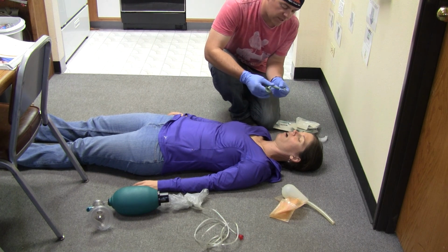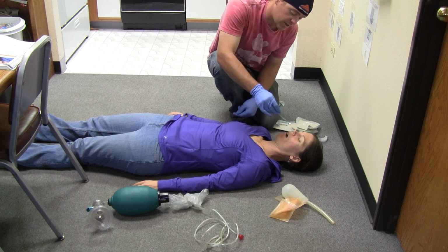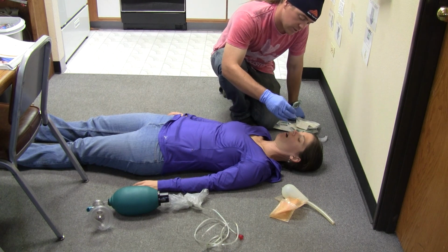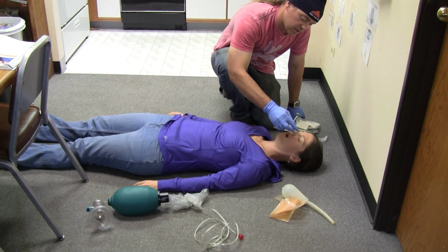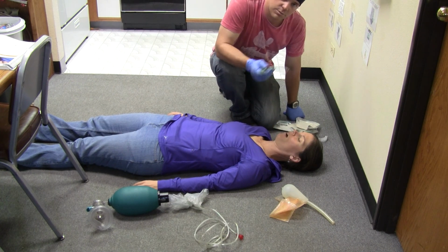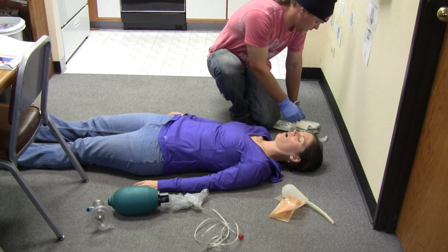You want to lubricate the tube in some way. Sometimes there are gels you have available you can use, or you can put it at the patient's mouth and get a little bit of their saliva on there as well. Stick it into the nose and just twist it like that and it will slide in. Keep in mind with this, their nose is going to bleed some. That's no big deal, that's just kind of normal. But that's the way you use an NPA.